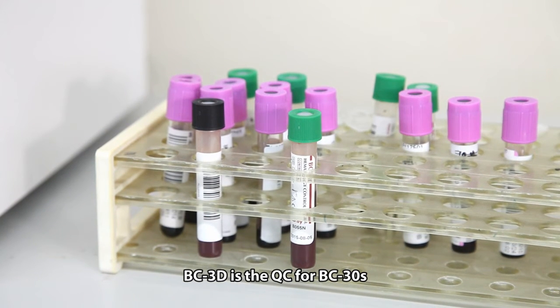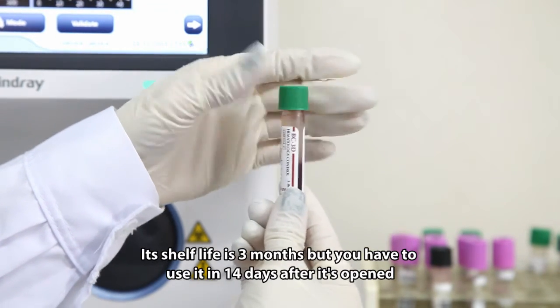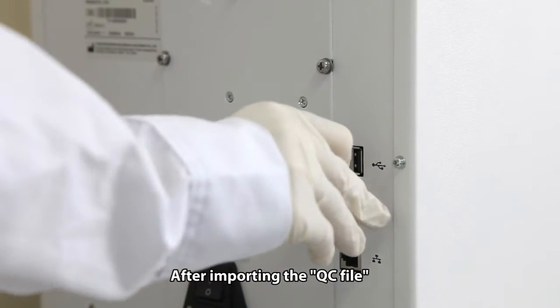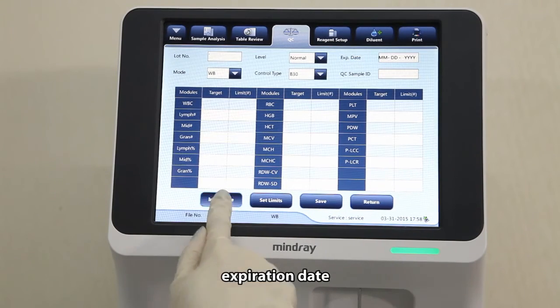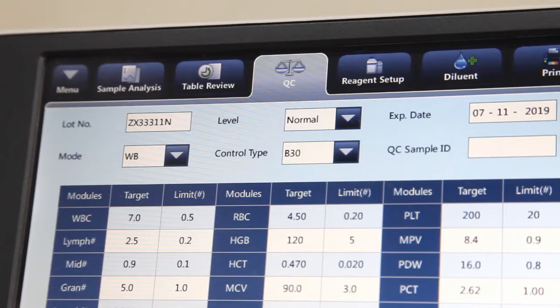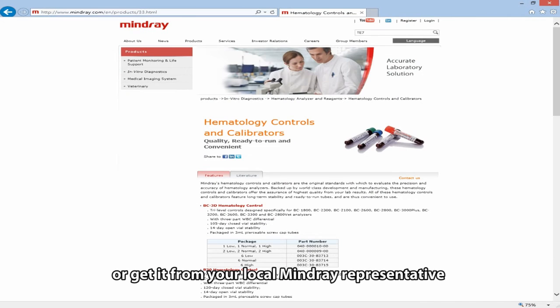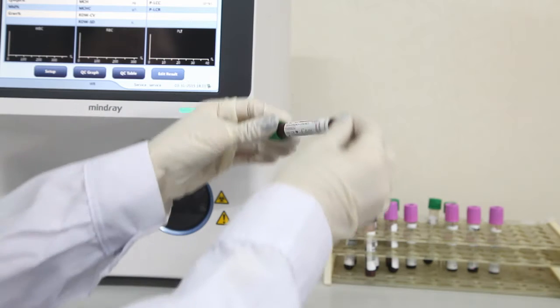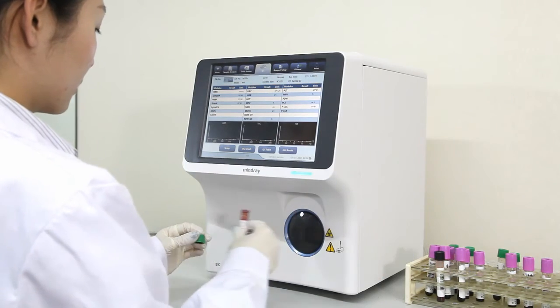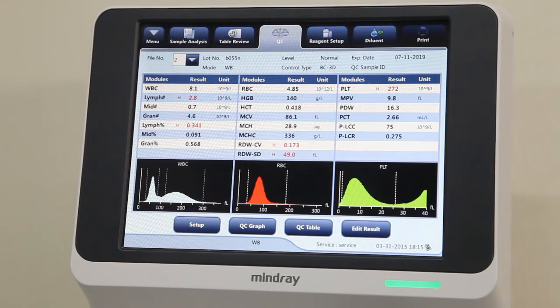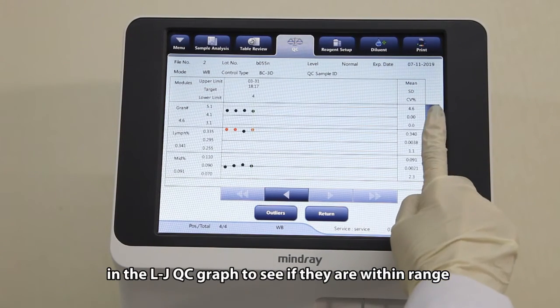BC-3D is the QC for BC-30S. Its shelf life is three months, but you have to use it in 14 days after it's open. After importing the QC file, BC-30S can load the target value, lot number, expiration date, and level of QC automatically. You can download the QC file from MindRay website or get it from your local MindRay representative. Run the QC through the sample probe in QC mode after mixing well. You may review the QC results in the LJQC graph to see if they are within range.